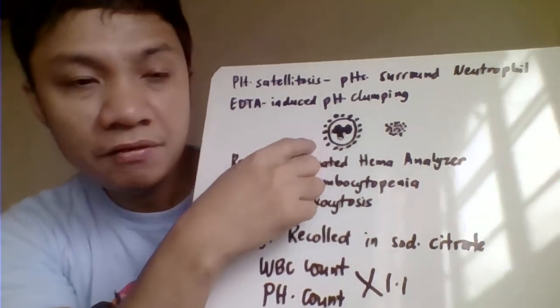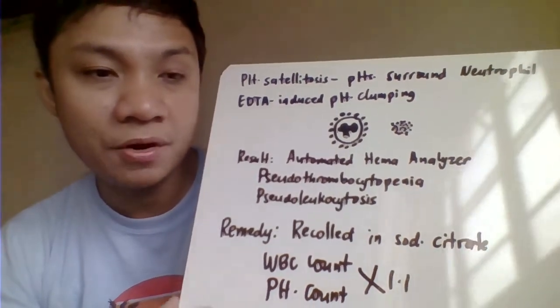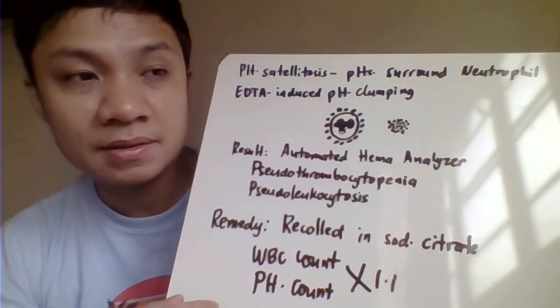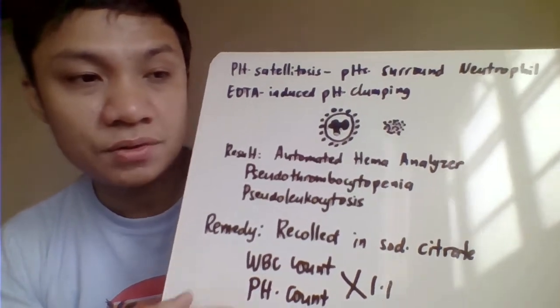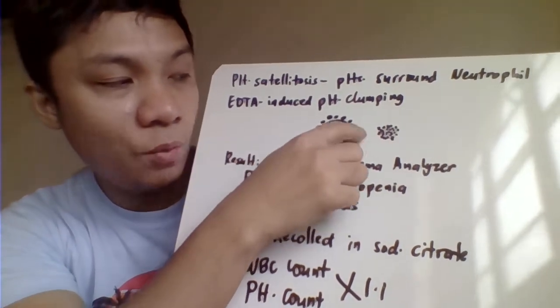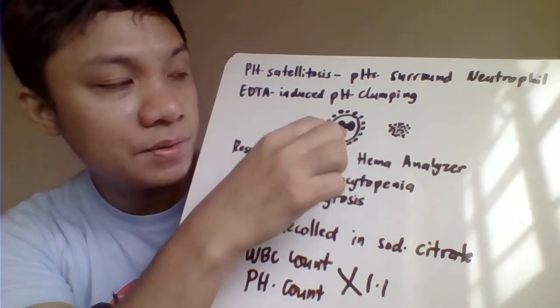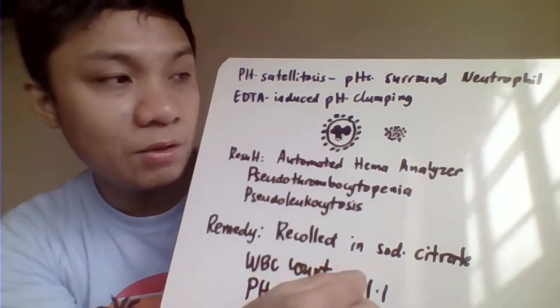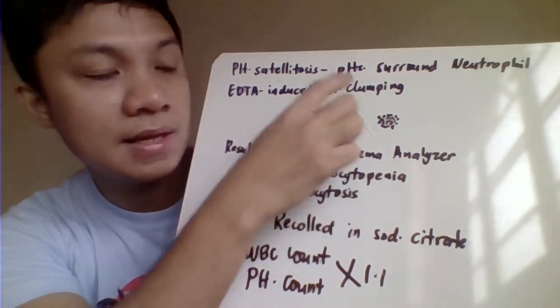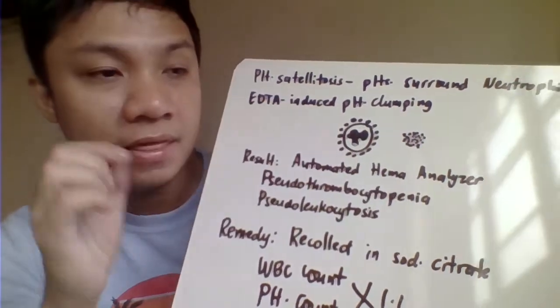Anyway, if you perform the platelet count with a manual method or an indirect method like blood smear identification, where you count platelets on the slide, and you encounter this, each of those small particles are platelets, and you need to count them individually as platelets. Each one is counted as one. The same is true with platelet clumps. You need to count them individually.